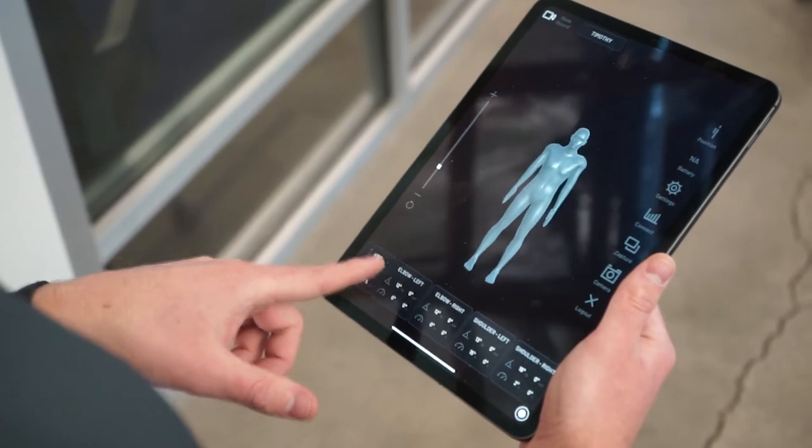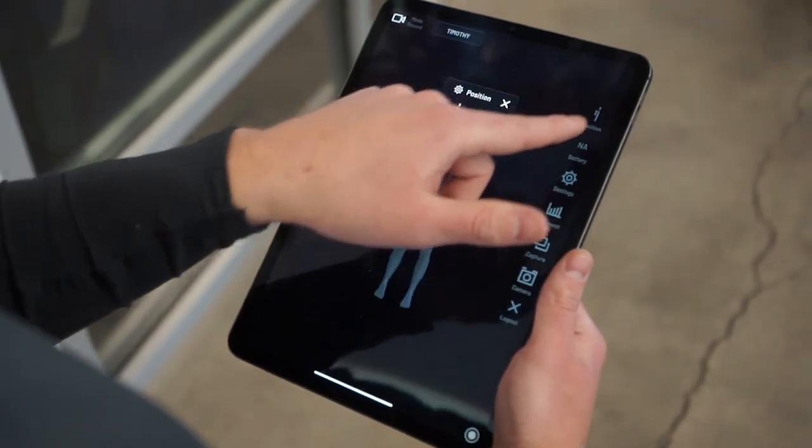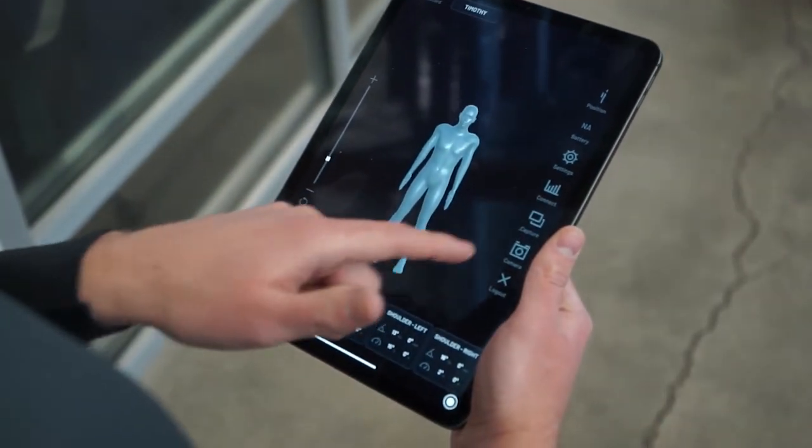In the top left of the screen we can toggle between modes and directly next to that we can change the user profile. At the bottom of the screen we can see the motion metrics in the cards. This includes flexion and extension for both shoulder and elbow as well as the associated angular velocities. On the right side of the screen we have the ability to change avatar position, view battery life of the sleeve, adjust a number of settings, connect to a BioSleeve, capture a real-time metric, and turn on the integrated iPad camera.